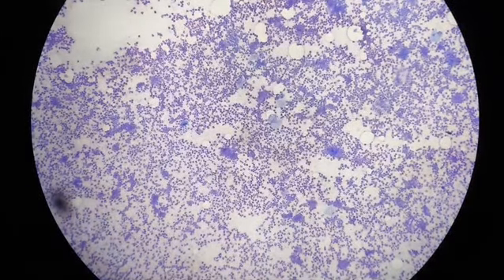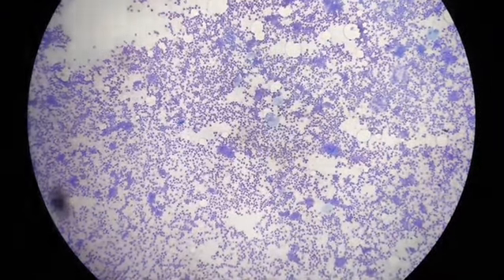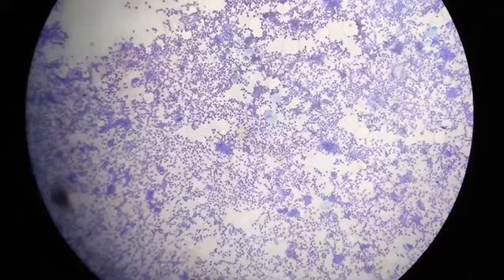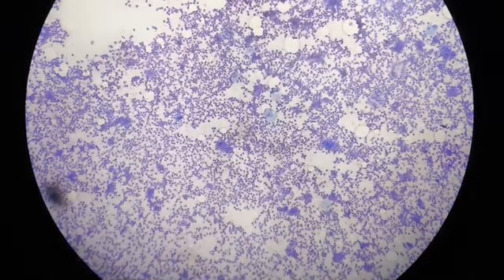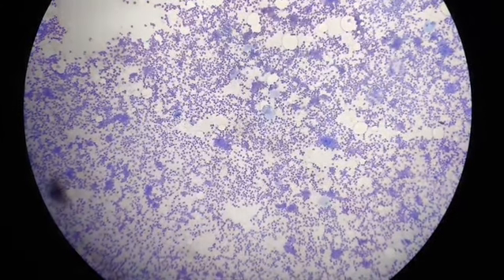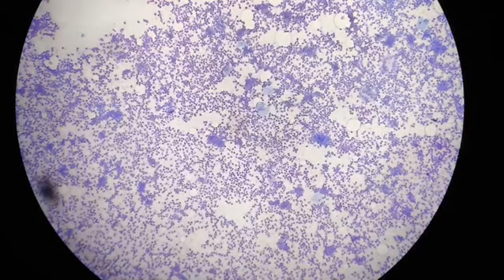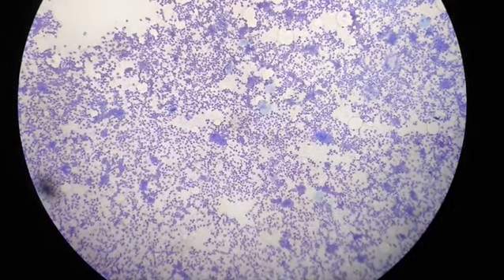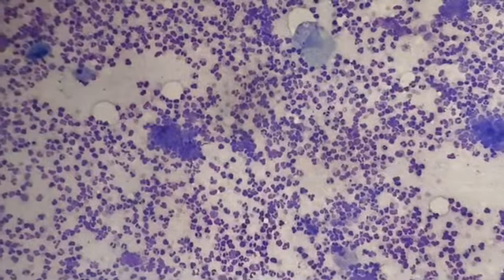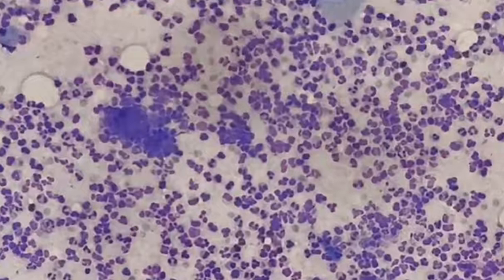So we did FNA and we got thin pus-like material which was blood mixed. Around 0.5 ml we aspirated, and then we made the smear and it was stained with Giemsa and Pap stain. Here, on low power, you can see it is a highly cellular smear, and you can see a few anucleated squames also. So these small areas are all your anucleated squames and dense inflammatory cells.